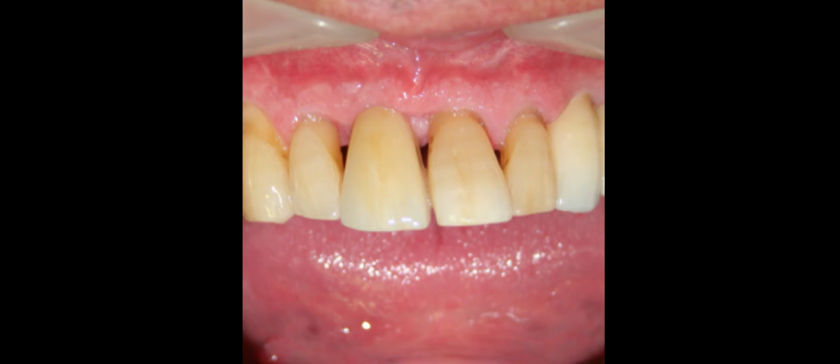Okay, so this is a close-up photo of his upper front tooth. This is the implant tooth right here, looking quite good considering the circumstances. We always knew he had gum disease. We knew that he had gum recession and these black triangle issues. But despite him not coming back for regular maintenance at all, he returned in June this year for a check and clean, and he's been able to maintain these reasonably well relative to everything else.